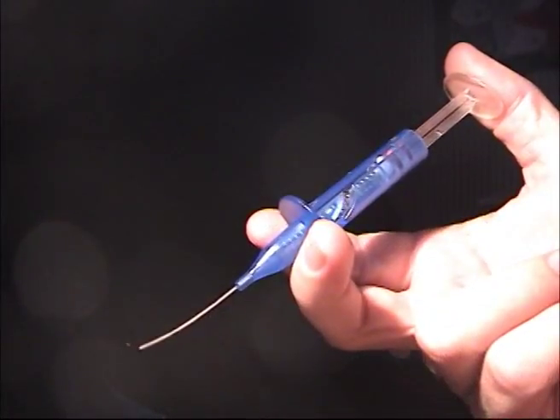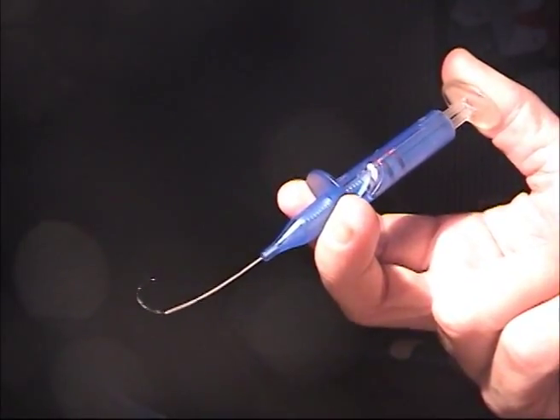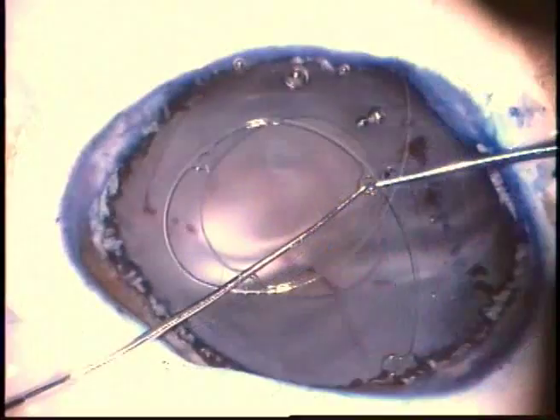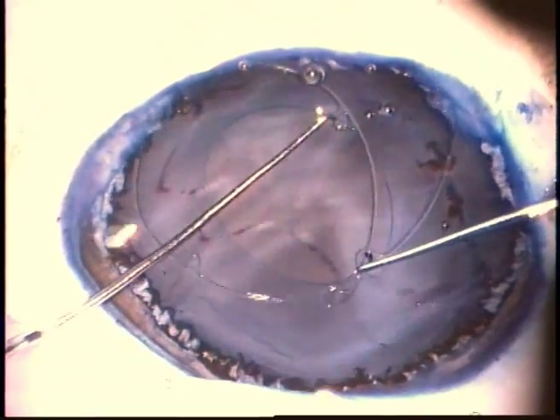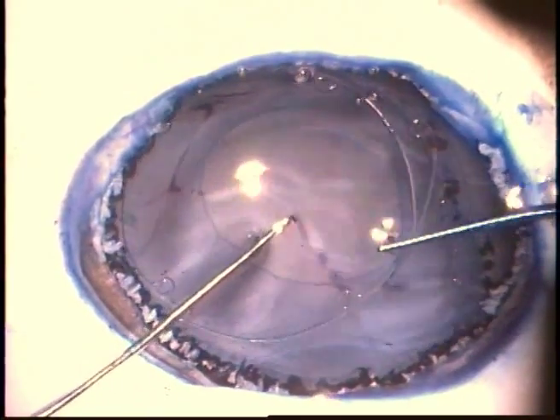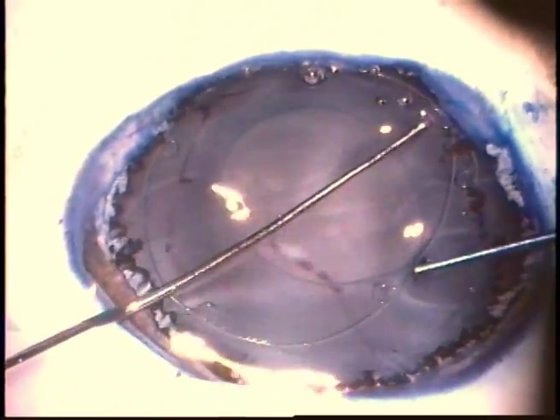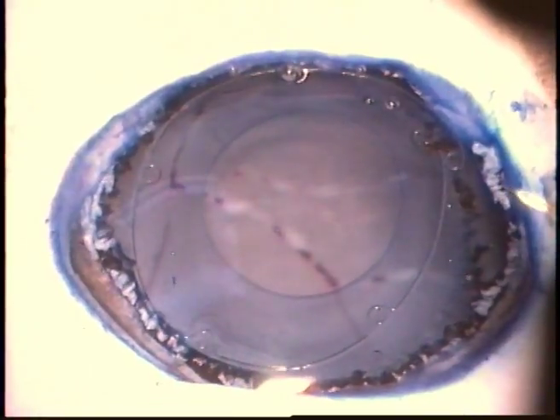The new design allows insertion of the capsular tension ring in the conventional manner using manipulators or plunger-based inserters. Furthermore, the newly introduced intermediate eyelets can be used to facilitate insertion of the ring in situations where pinpoint contact between the ring and the capsule wants to be avoided. For example, the ring can be initially placed in the anterior chamber and then easily transferred to the capsular bag using two rotators, avoiding single point contact in delicate zones.